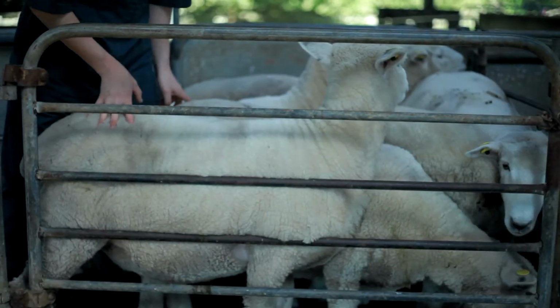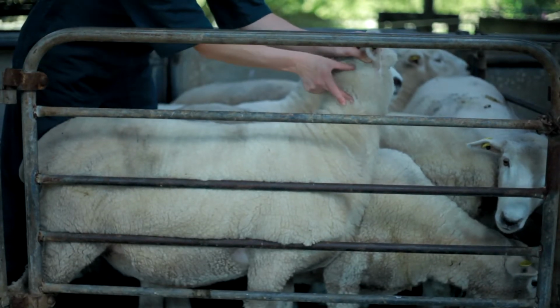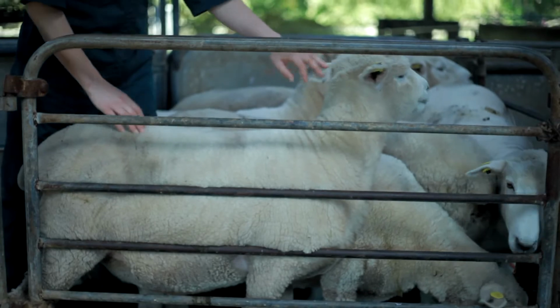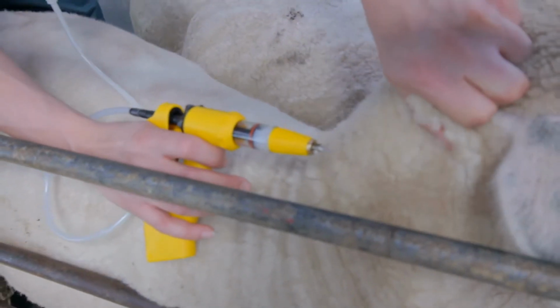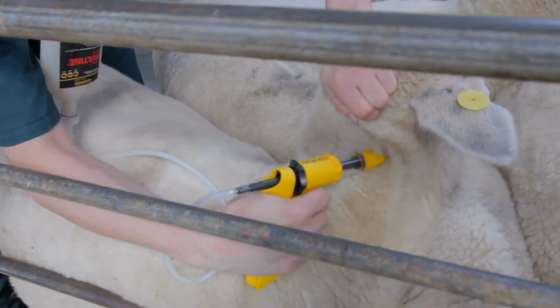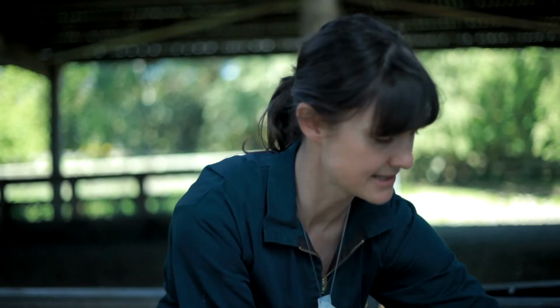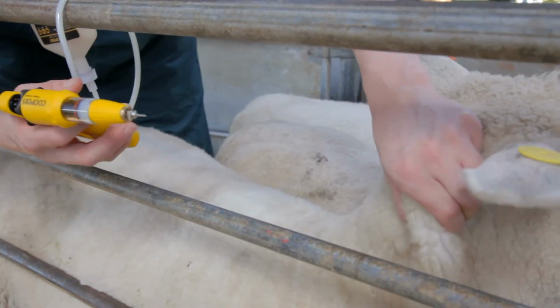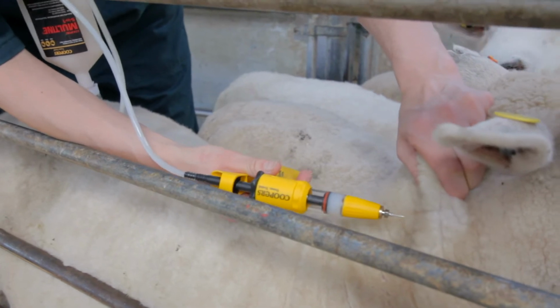The approved vaccination site for sheep and cattle is the anterior or front third of the neck. To administer a sub-Q vaccine, angle the needle at 45 degrees to the skin, so the needle penetrates the skin but not the underlying muscle. To ensure the needle does not penetrate the underlying muscle, use your finger and thumb to form a skin tent. This is the area that you vaccinate into.